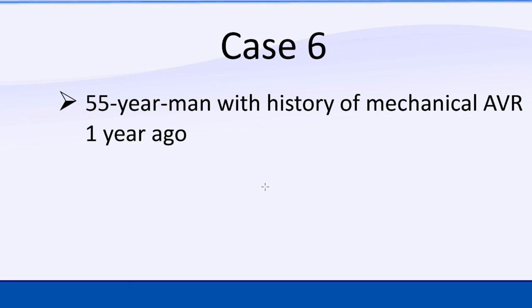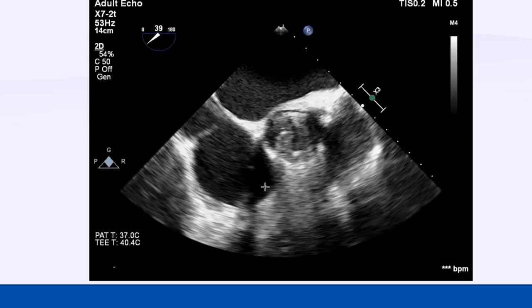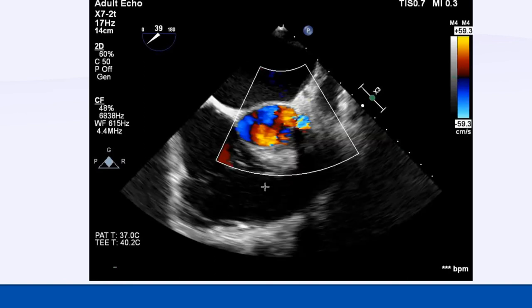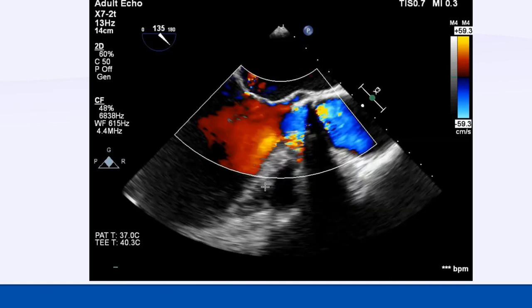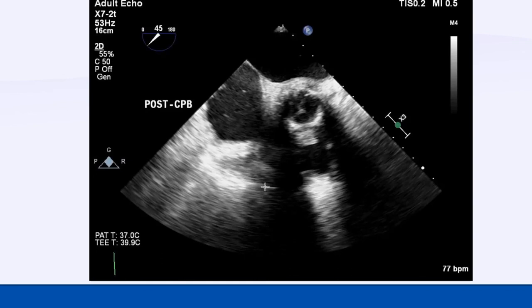The last case is a 55-year-old man with a history of mechanical AVR one year ago, a case from a couple of days ago. This is a mechanical aortic valve. I showed more mitral cases because paravalvular leak is more common in mitral. Here you can see the paravalvular leak, and this valve was replaced by a bioprosthetic valve.